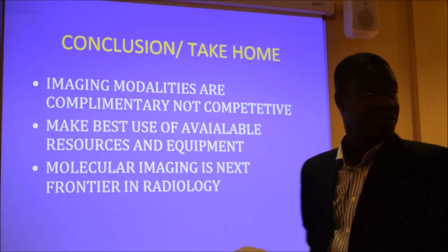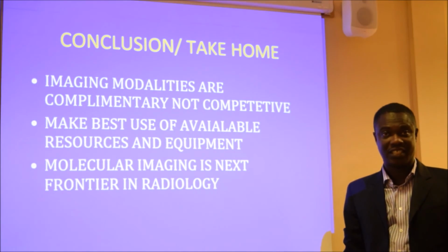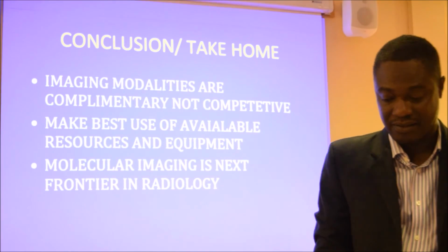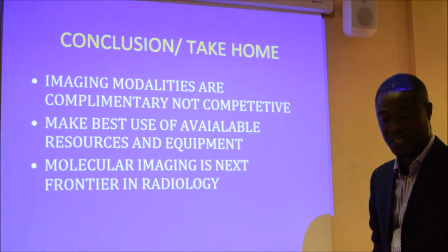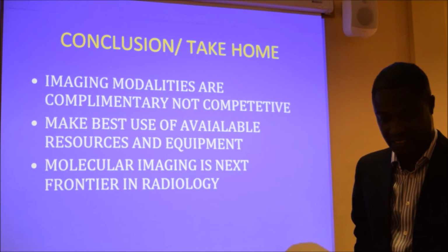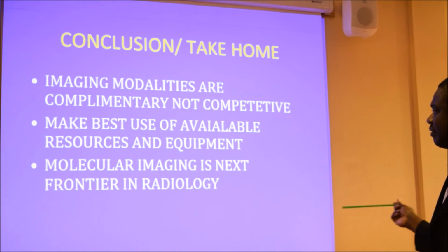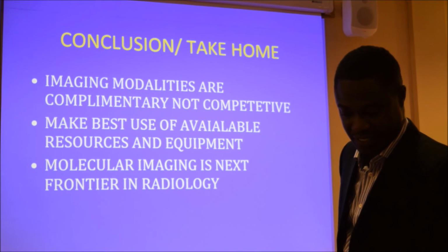Right, so just a few take-home messages. Imaging modalities are complementary to each other. They are not competitive. You're not going to say that X-rays are always better in one case, or I only use CT scan. They always complement each other. And we need to make the best use of available resources and equipment, and also bear in mind that cost implications need to be considered, and that we're obviously moving towards the era of molecular imaging, with PET-CT scan probably leading as the next frontier in radiology.